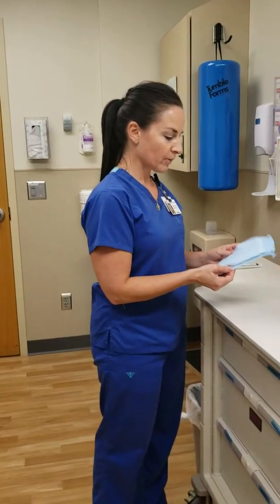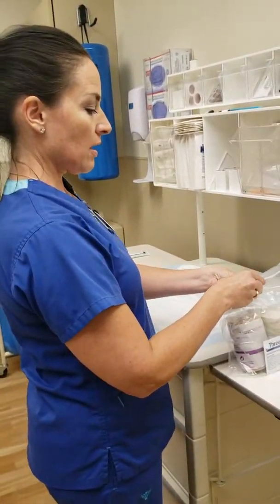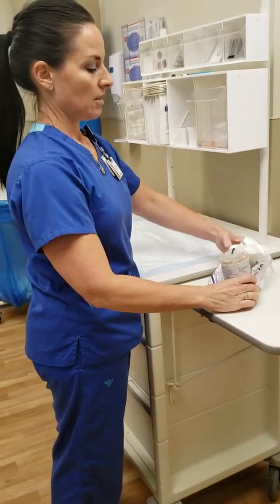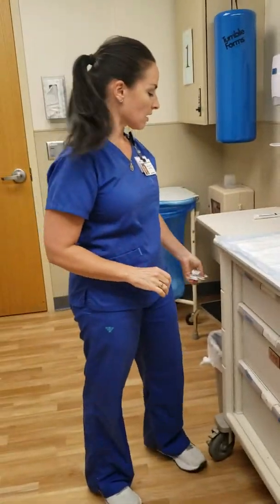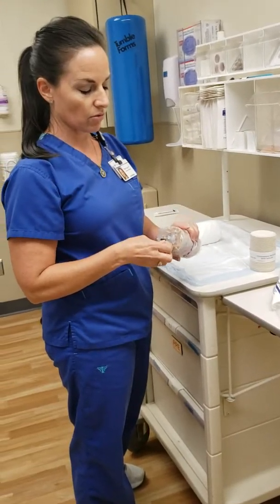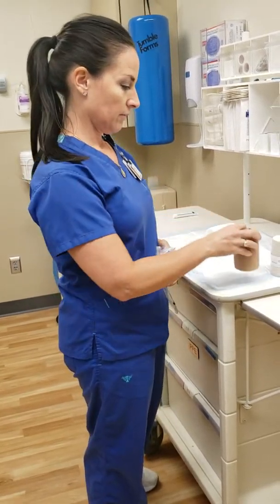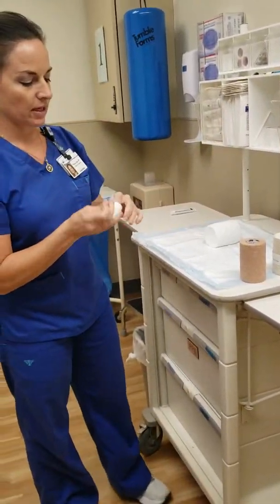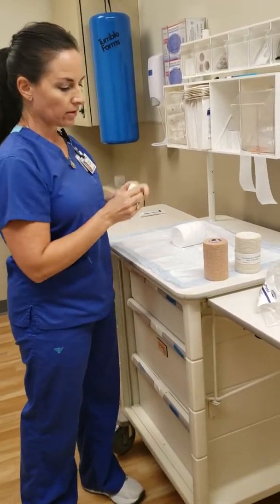This is a video for how to do a multi-layer compression wrap system. We tend to use a three-layer wrap system. I'm going to go ahead and put my supplies out, only touching the edges. I'll take the cotton roll and set it out on the field. We're assuming the dressing is already on the patient. The other two rolls can go on the side of the field. You want to hang some paper tape — I don't need one for the cotton layer, but I like to have three for the ace wrap layer.